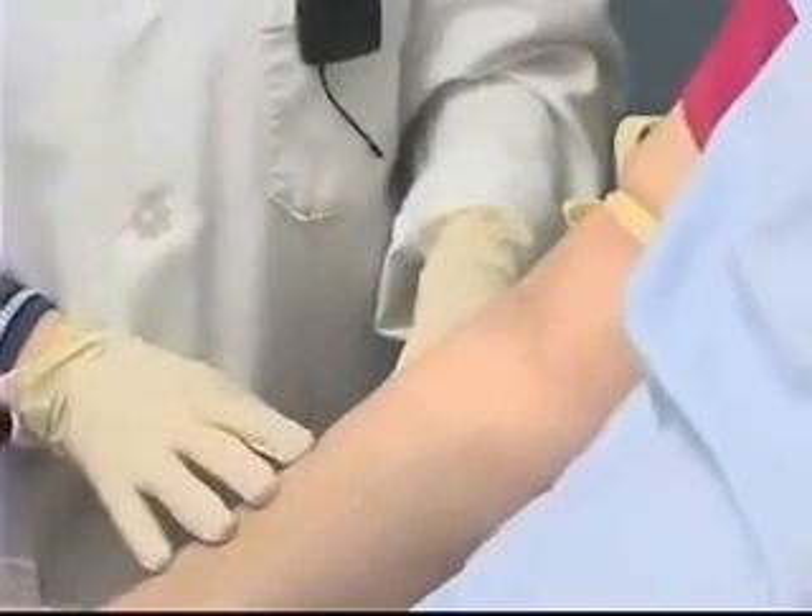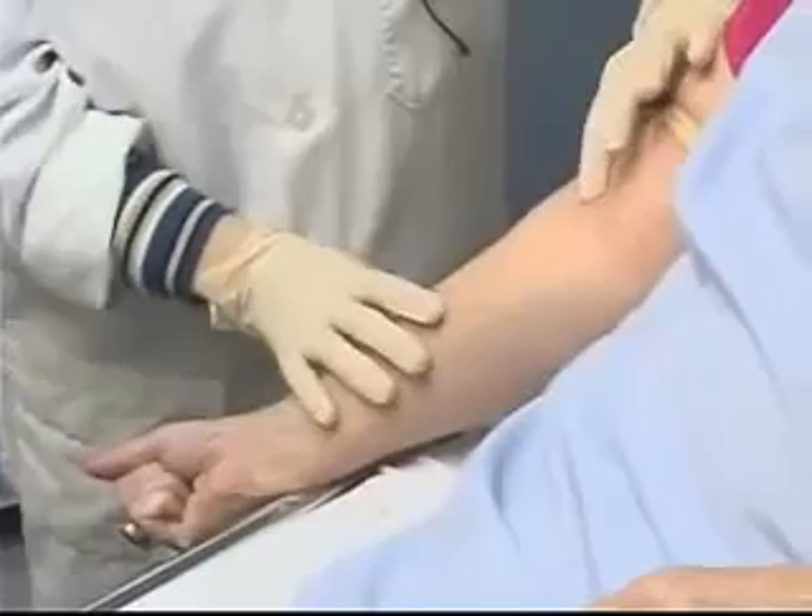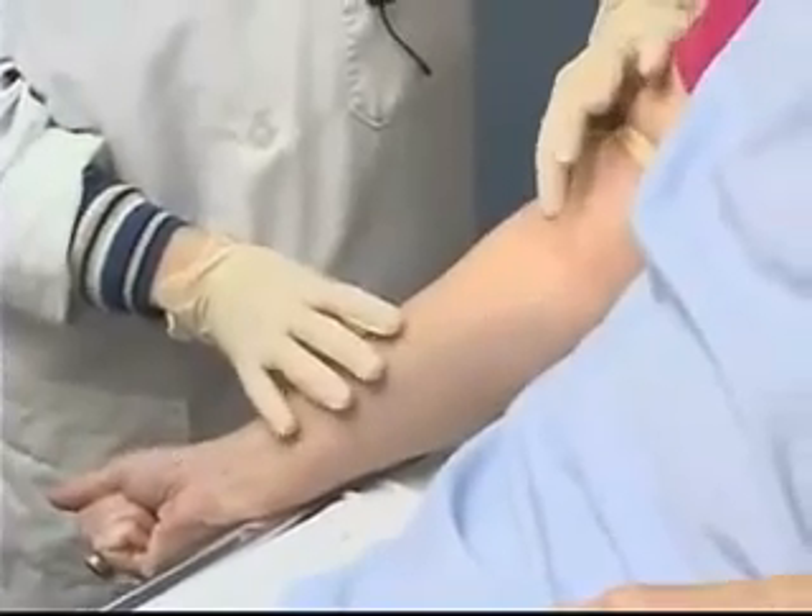I'm going to ask my patient if she'd please make a tight fist for me. I'm going to feel the area and I can feel that vein.